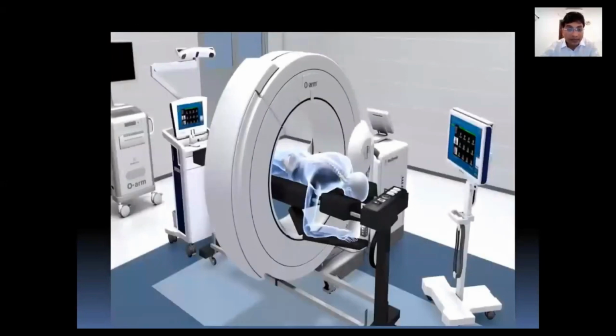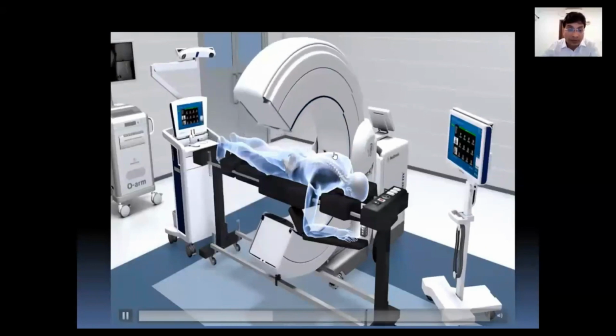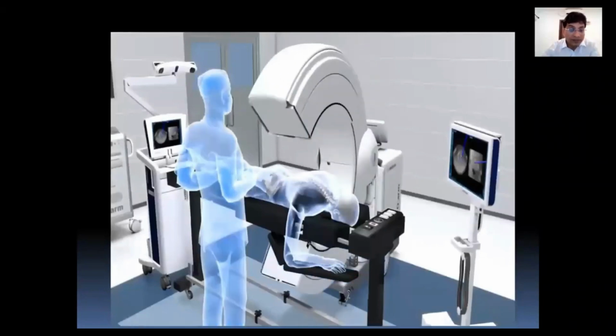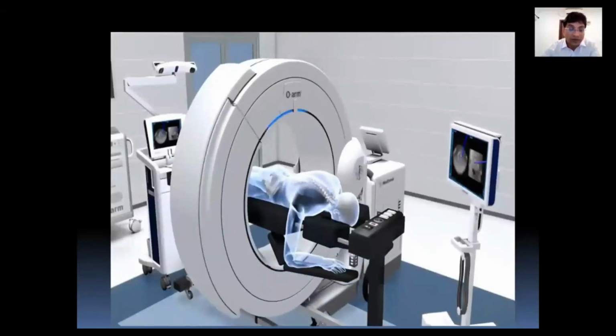It scans the patient with a three-dimensional shoot. These images are transferred to the software, and then the O-arm goes out of the operation theater. Now the surgeon comes in and performs the surgery under 3D navigation without exposure to any radiation. And the placement of screws is nearly 100% accurate, which you can confirm again with another shoot after the surgery.